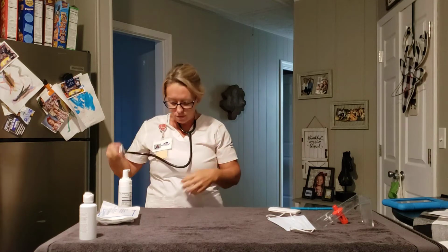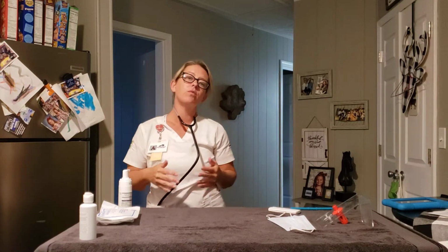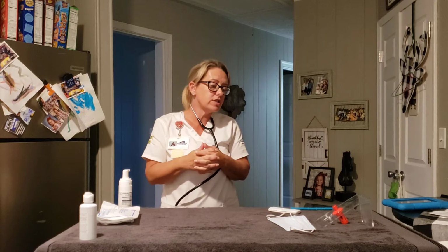Okay, it sounds a little wet and frothy, so we're going to go ahead and continue with the trach suctioning. Do you have any questions so far, Ms. Fitzgerald?